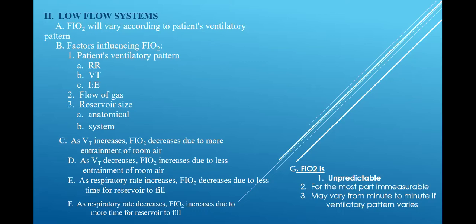21%. Good. So the more 21 you put on it, the more water you put on the Kool-Aid, the less the concentration of the Kool-Aid will be. And the opposite is also true. As the tidal volume decreases, the FiO2 is going to jump up because of less entrainment of room air.